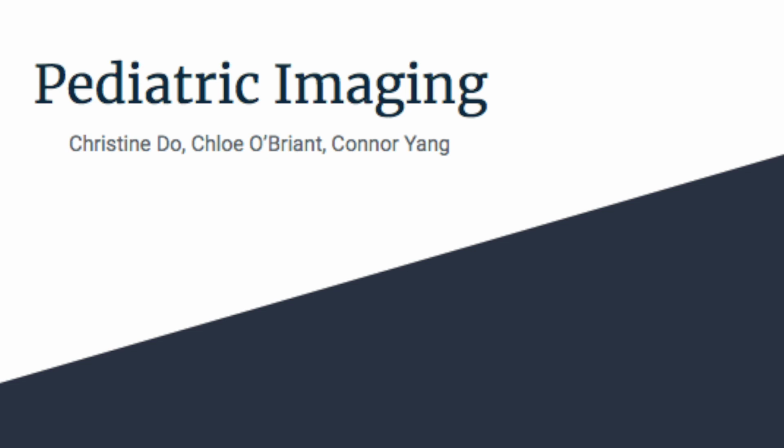A pediatric patient is defined as one between the age of 0 and 18 years old. These patients are usually not yet skeletally mature, which requires that some radiographic procedures be performed differently. Main points to consider during pediatric imaging are communication, immobilization, and common procedures. We will demonstrate and explain how to properly perform a routine exam to achieve quality patient care.